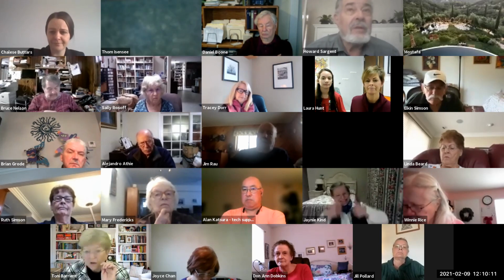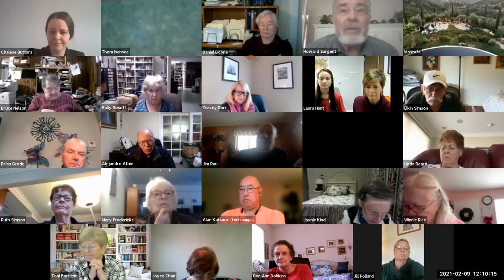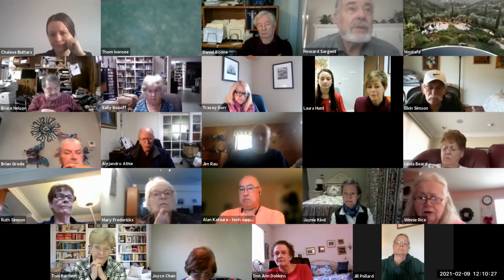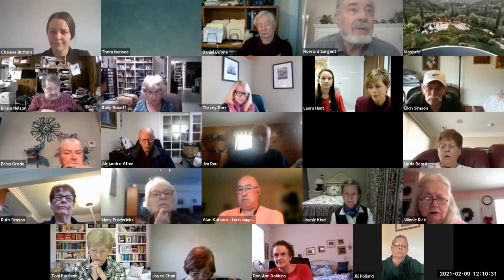We do have a question from Sally. It says, my ear canals are malformed due to multiple ear infections as a child, so I can't use earbuds. How would that affect wearing hearing aids? Well, I would say as an audiologist, that is right up our alley. We would be able to look at your ear canals and modify something with a custom ear mold in order to make it work.